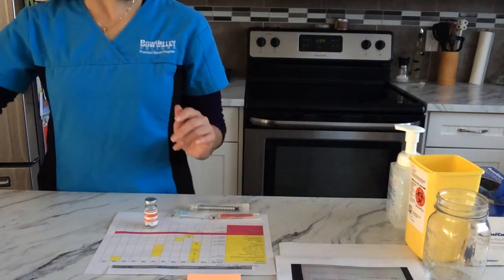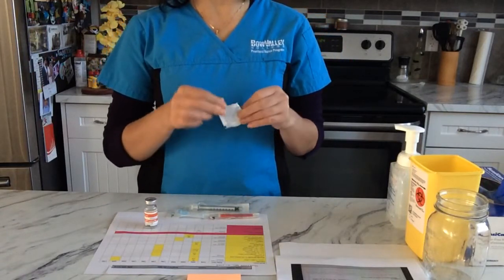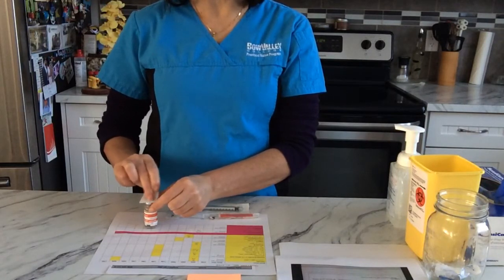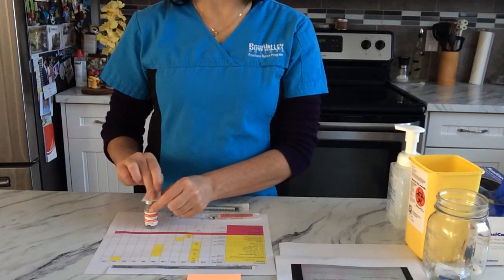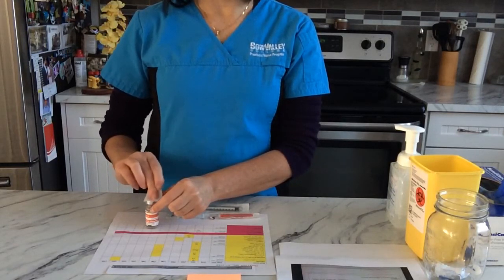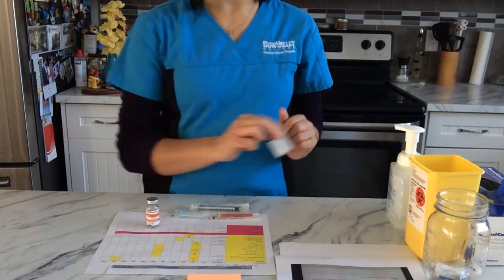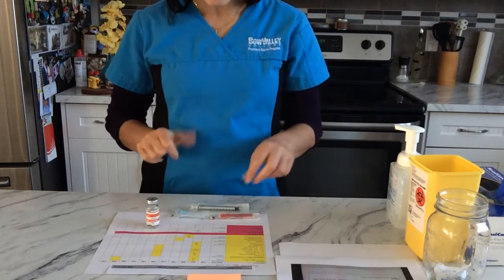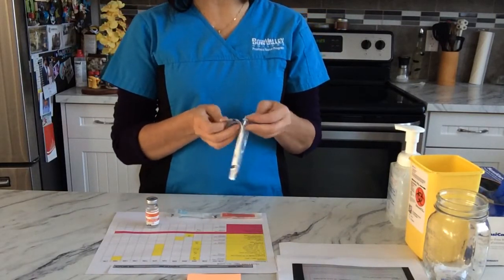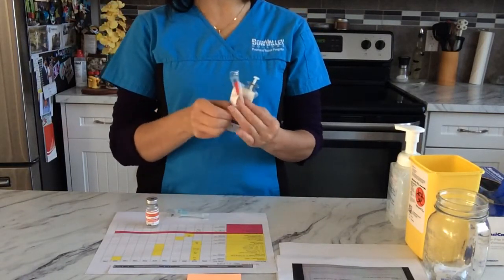So we clean the vial first. We'll clean the vial for 30 seconds. And I'm gonna let it dry. Now I'm gonna open my syringe.